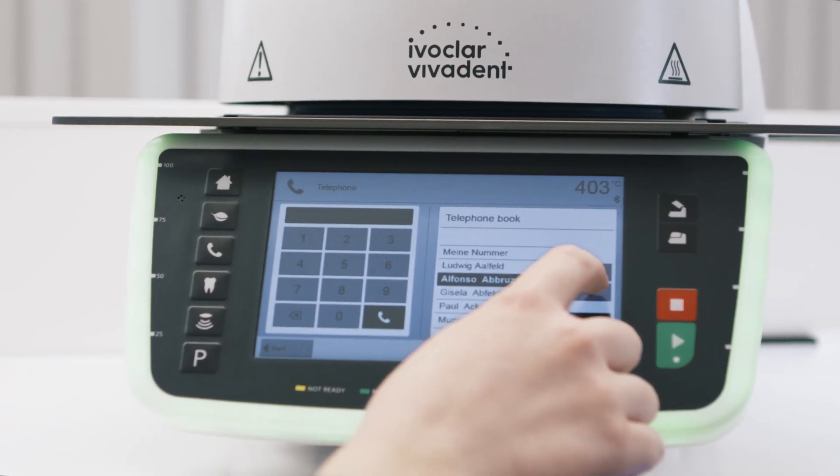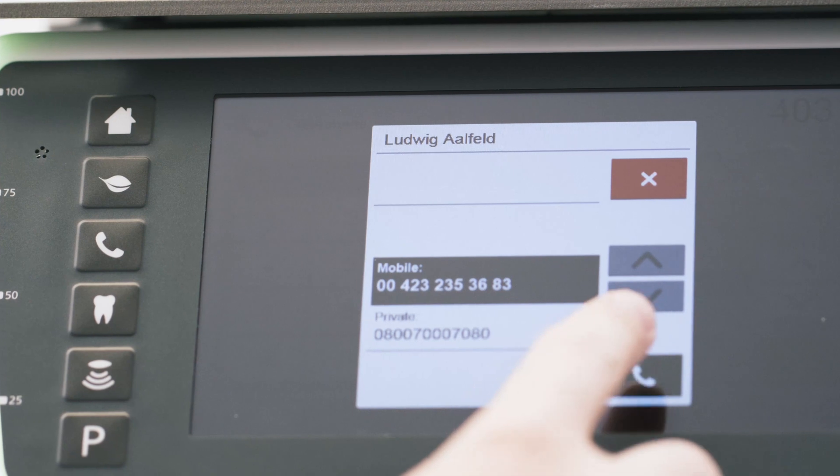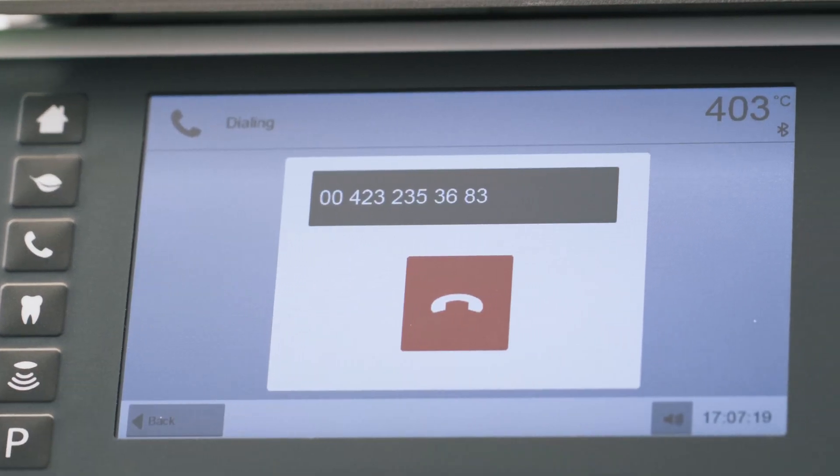If several numbers are stored for the same contact, a new window opens. You can now select the phone number that you require for that contact.